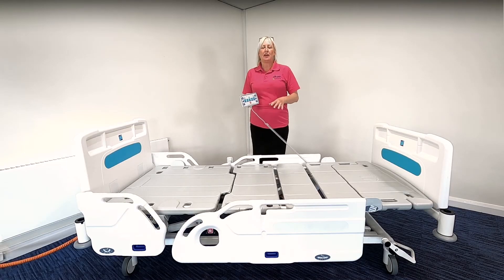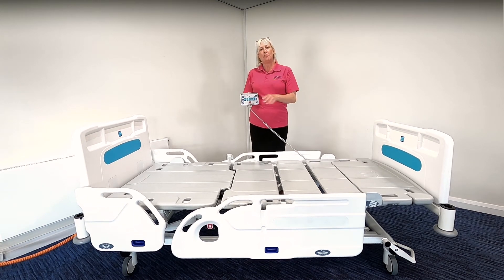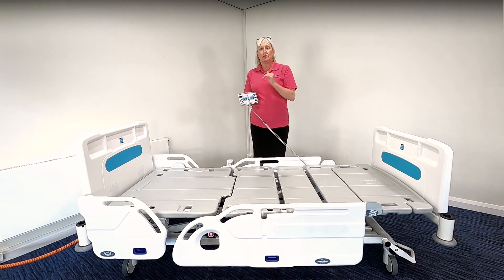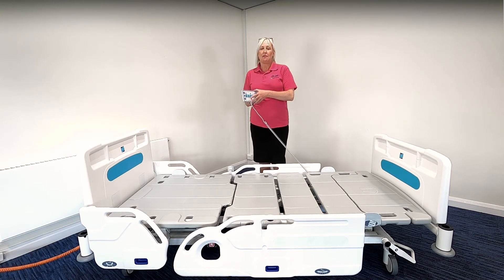We're now going to demonstrate the profiling functions of the bed. For the platform height, simply press the platform height function button and then the up direction arrow to raise the platform. The platform will raise to a maximum of 75 centimetres to assist with maintaining a neutral posture. To lower, press the platform function button again but this time the down arrow. As you reach 42 centimetres height you will hear a beep, informing you that any lower the platform is going below 42 centimetres into its lower height.